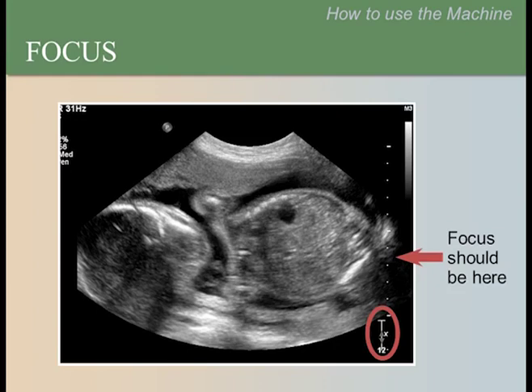The focal zone is now in the far field below the fetus. It should be moved up to focus instead on the fetus. You will have a chance to learn and practice setting the focus appropriately in our hands-on sessions.